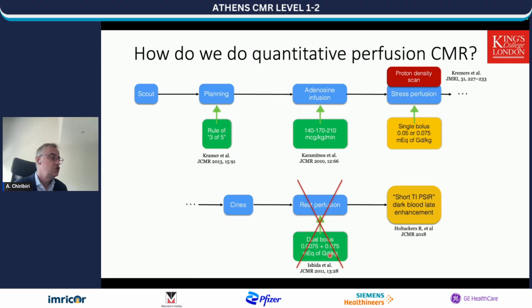You will need a dual sequence acquisition to correct for the saturation of the signal. A dual sequence is effectively a sequence with an additional slice in the acquisition, which is hidden from your view, which acquires the input function with a different T1 sensitivity to prevent saturation effects.